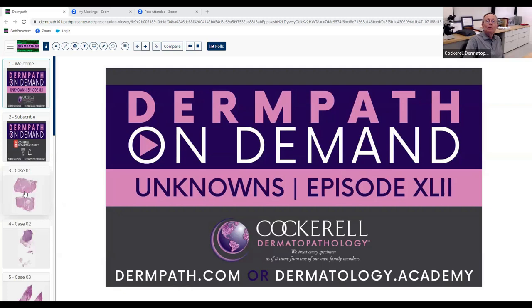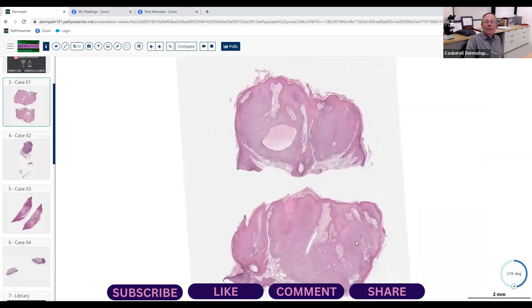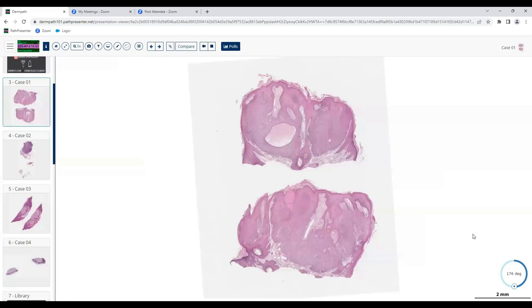All right, let's get going. These are some good cases this morning, and I think most of them are fairly characteristic of stuff you could see on the exam. So this one I thought looked like a benign neoplasm. It had a connection to the epidermis and it's made up of a lot of what looks like keratinocytes, but they look a little bit different than the keratinocytes we normally see.